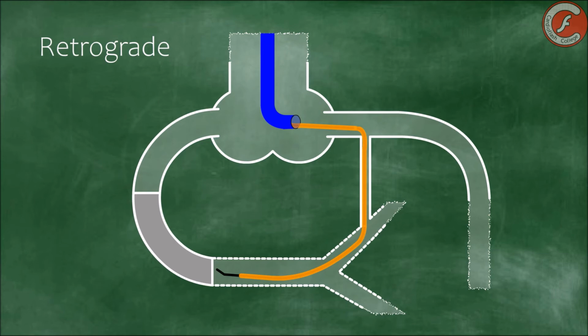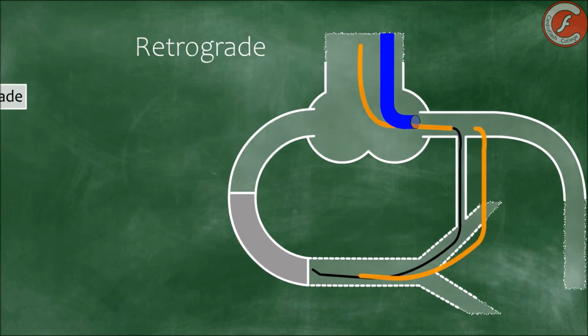In this particular case, the microcatheter is an essential tool for the success of the procedure because it does not only offer support, push, or the opportunity to exchange guide wires, but also offers the opportunity for dilating the collateral vessel with the intention of facilitating the displacement of balloons that could be posteriorly necessary during angioplasty.